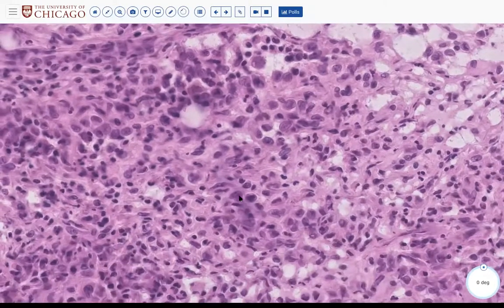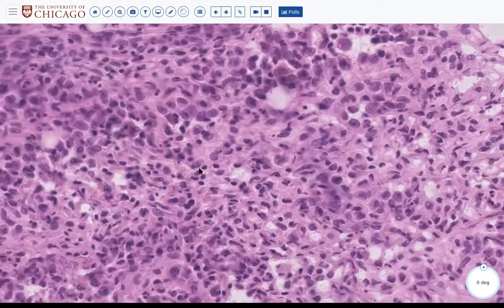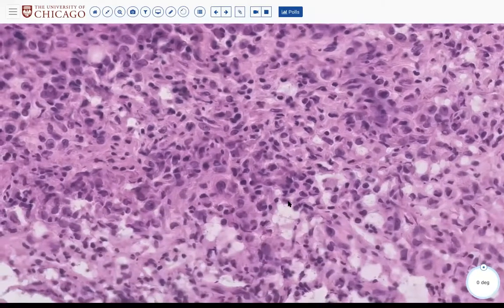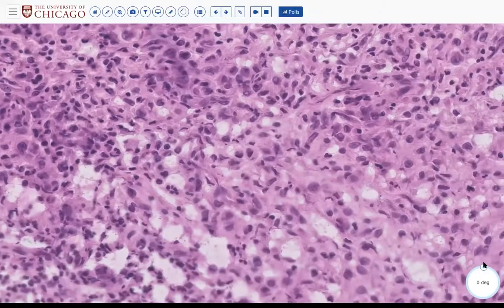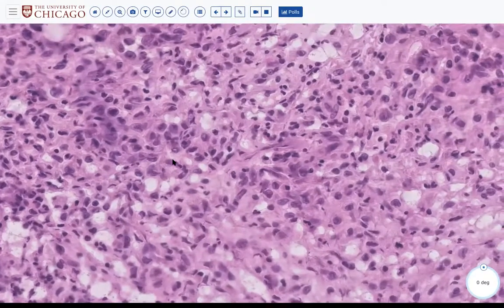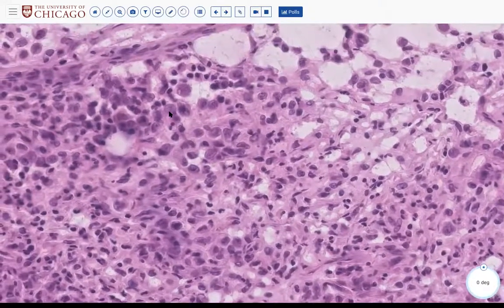It doesn't really look right for a Langerhans cell, but I don't know. Ben agrees with you. Mononuclear, eosinophilic, grooved nuclei. Well, that's heartening.